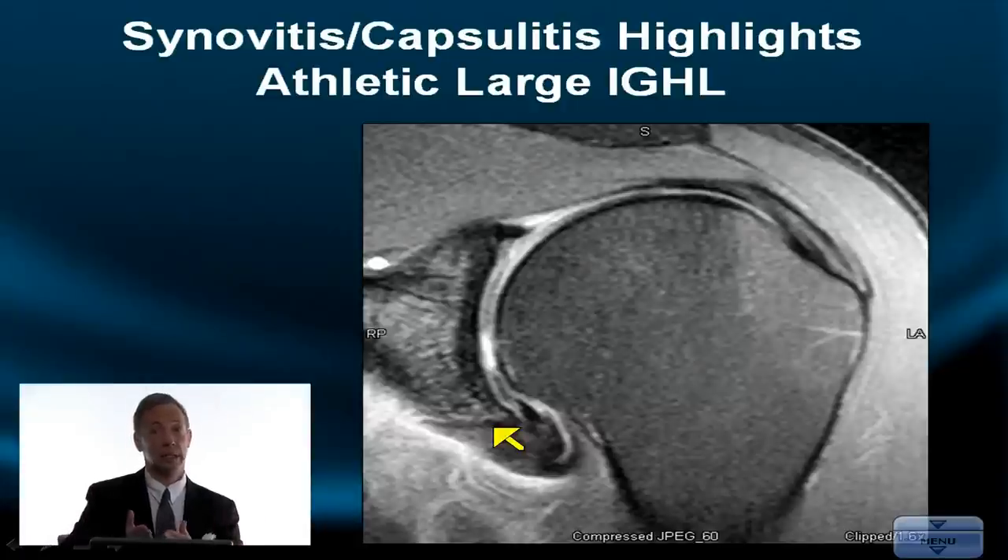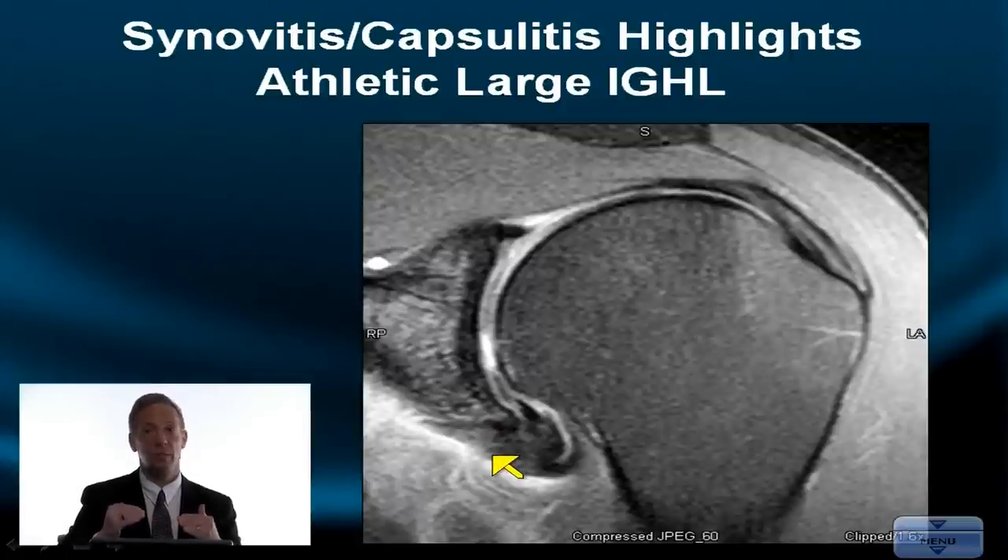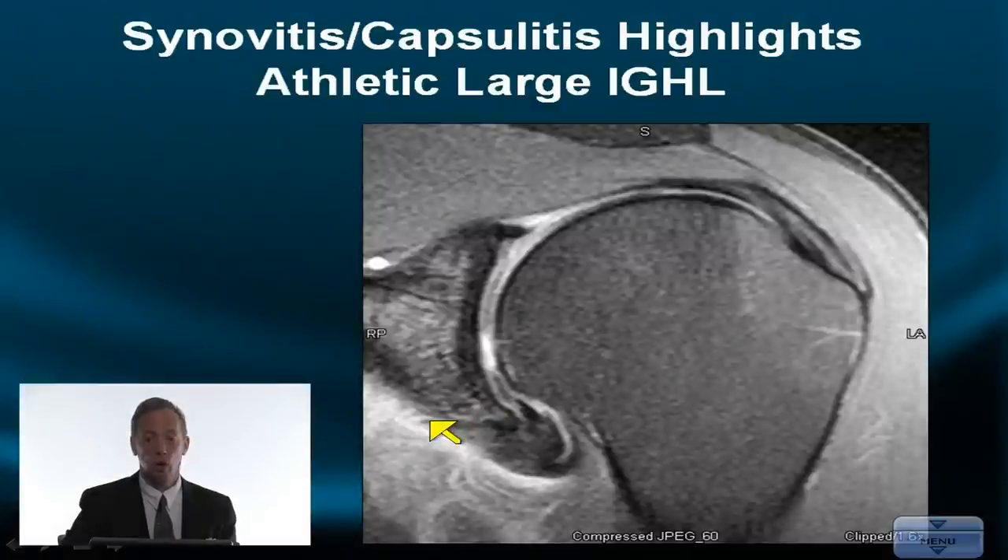The transition between those structures is very ill-defined in some patients, as we introduced in the prior vignette. There is a small fissure between the labral ligamentous complex and the glenoid cup — that fissure doesn't belong. It's not a symptomatic fissure, but it's not allowed to come out the medial side. This fissure represents a site of prior, slightly inflamed yet solid repair, so this is not a normal, virgin, unoperated shoulder. This is an example of what I call clefted medialization in the lower quadrant of the glenoid cup.